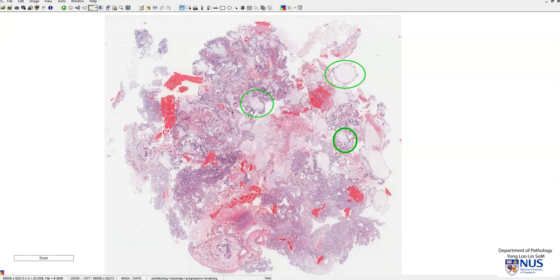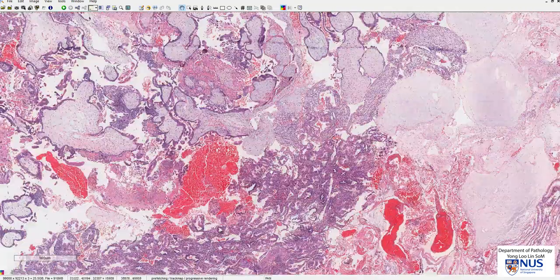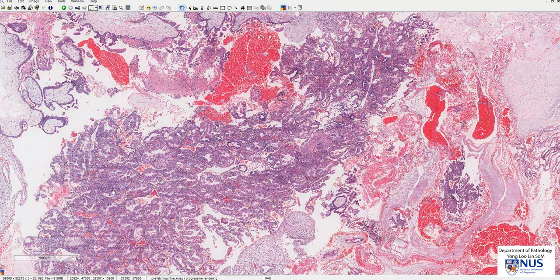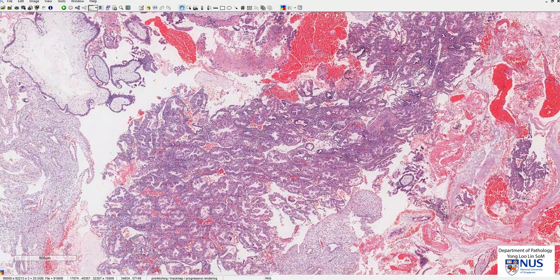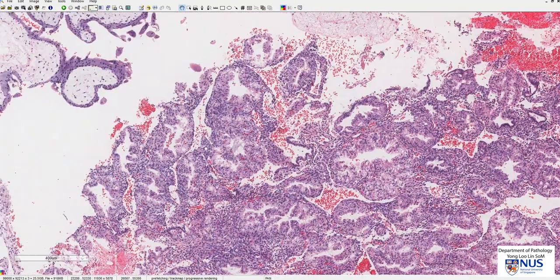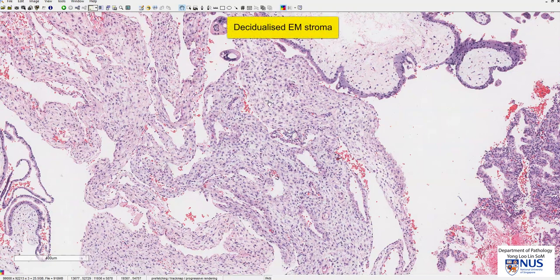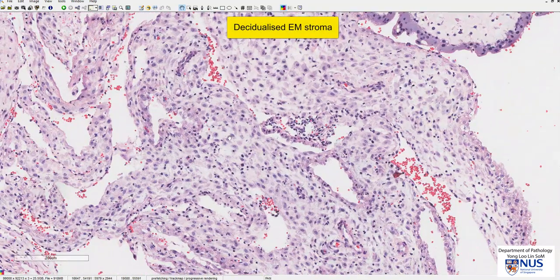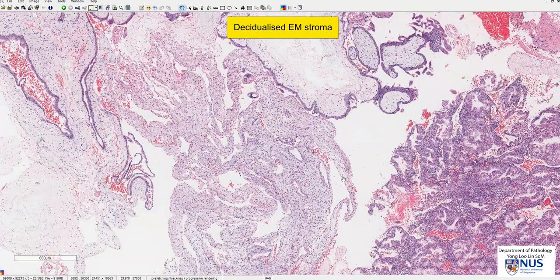Let's focus on the microscopic features here. We are looking at some endometrial tissue, which is not surprising because this is a uterine curettage. We have secretory endometrial glands surrounded by stroma. In some areas, the stroma is markedly decidualized with very plump, large cells with low nuclear-to-cytoplasmic ratios, which is not surprising because of the progesterone effect.